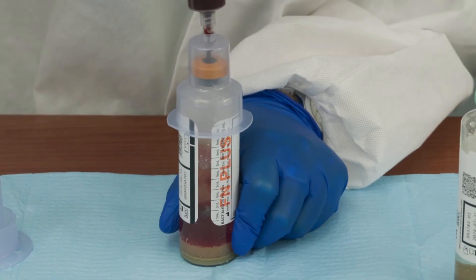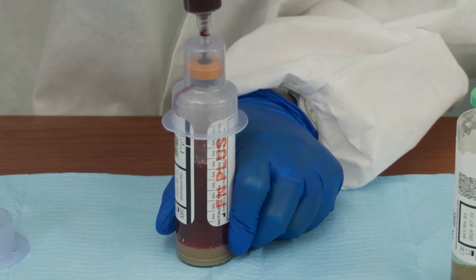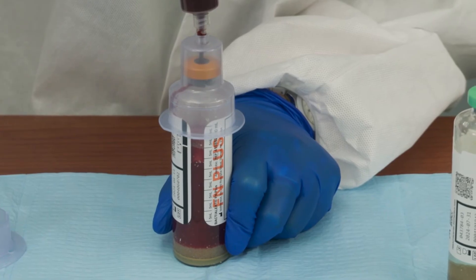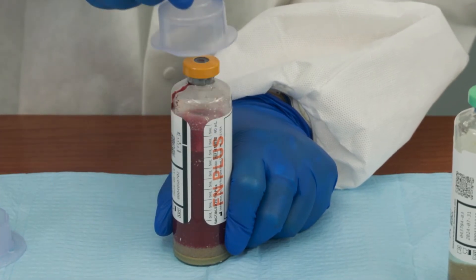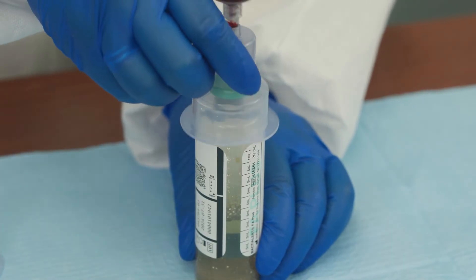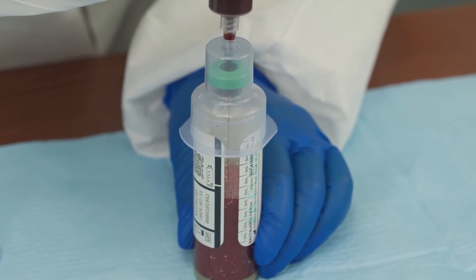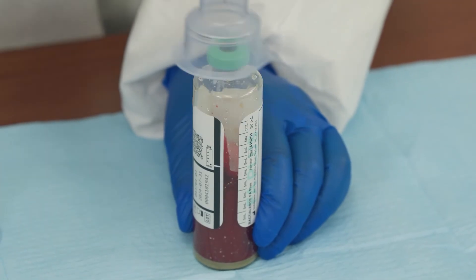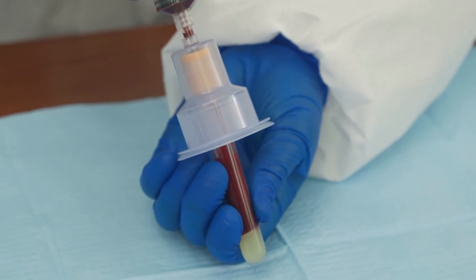Inoculate the anaerobic bottles first to avoid adding air that may be in the syringe, which would alter the atmosphere of the anaerobic bottle. Use the fill-to mark to accurately gauge the sample volume — 10 milliliters per adult bottle. For pediatric patients, you may choose to use a unique pediatric aerobic bottle. Once the anaerobic bottle has been inoculated, lift the syringe and transfer device off the anaerobic bottle and repeat the procedure for the aerobic bottle, again using the fill-to mark for 10 milliliters per adult bottle. If other blood tests are required, always inoculate the blood culture bottles first.